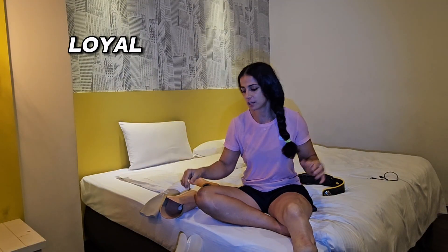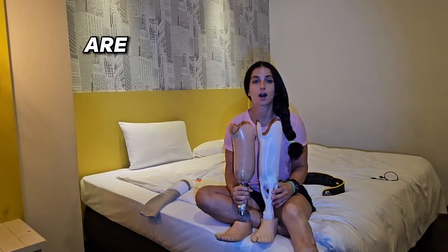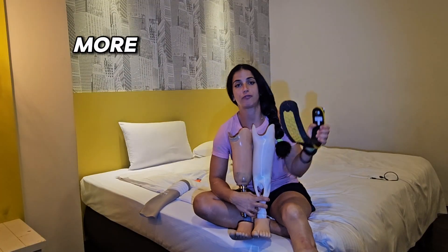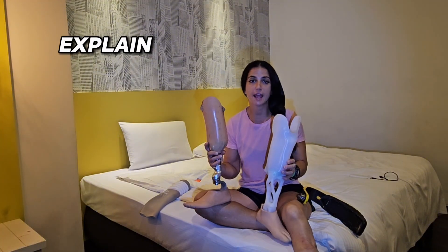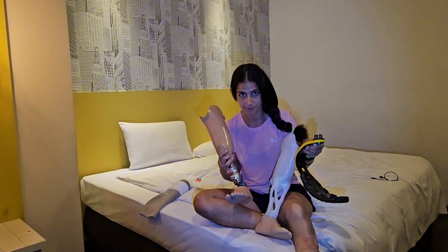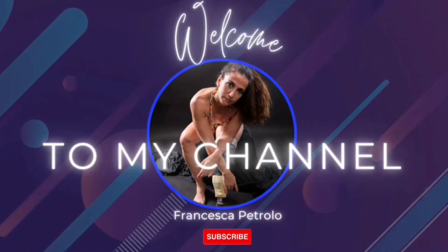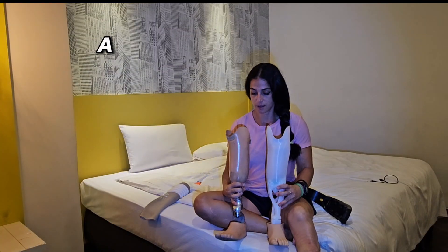Welcome back! The topic of today is obviously legs and feet. I'm here to explain the difference between these legs and the whole feet that you see right here, so there is a lot to say.